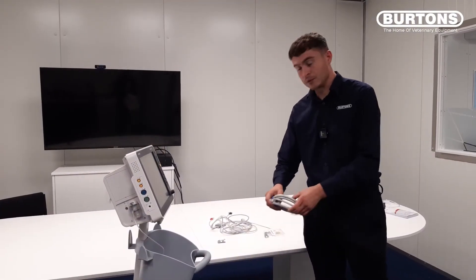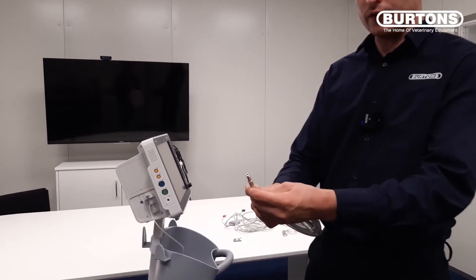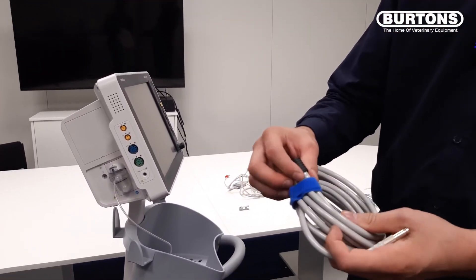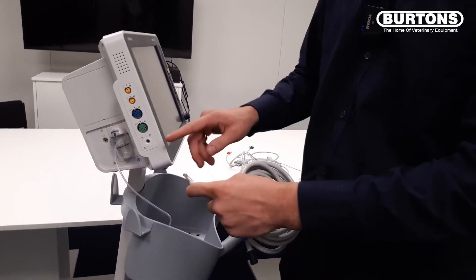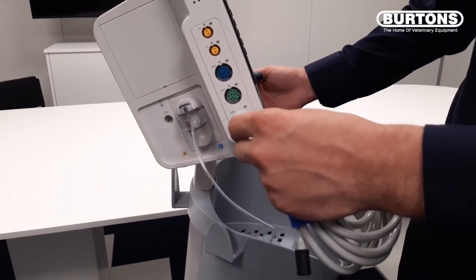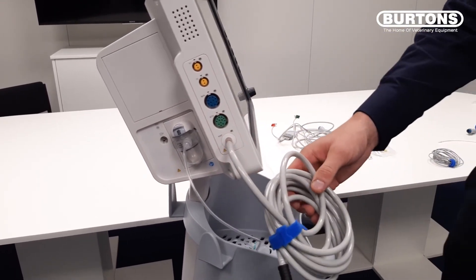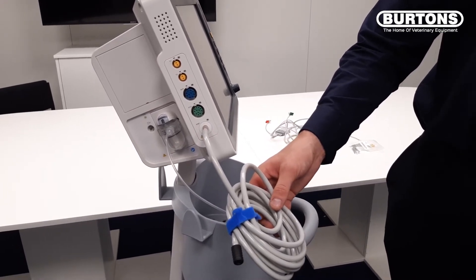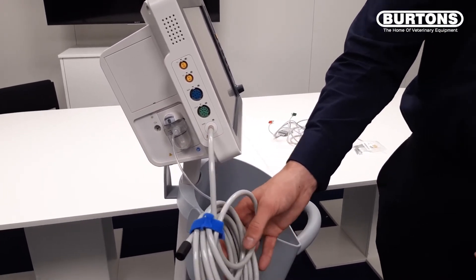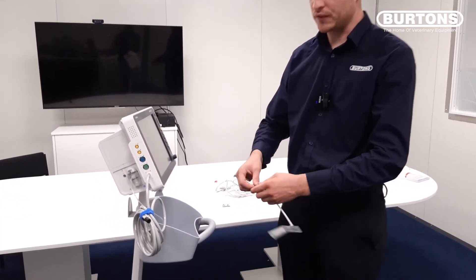Next I will show you how to attach the blood pressure hose. You will see on one end there is a metal end and on the other side a plastic end. We will slot this into where it says NIBP. It's important to mention that if you are requiring invasive blood pressure, we do have alternate machines that allow you to do this. This is a non-invasive blood pressure cuff to attach.